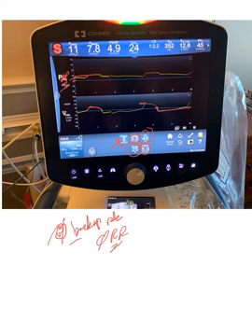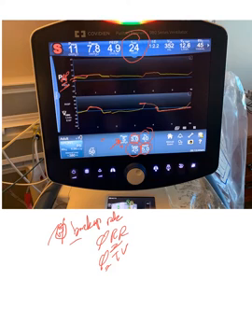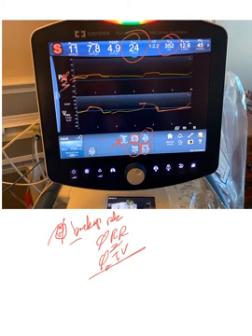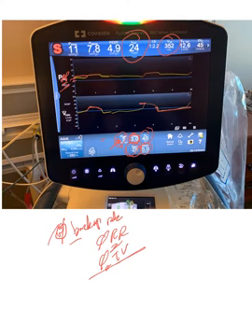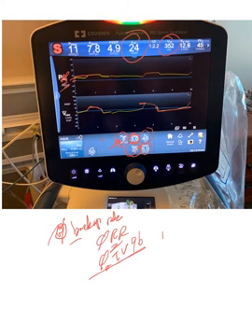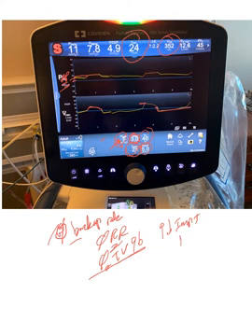There is no backup rate, no respiratory rate set — there is only the actual respiratory rate. There is no tidal volume set; it's whatever the patient can pull. We only provide the pressure support target, the trigger — whether it's a flow trigger or pressure trigger. To go up and down on tidal volume, you can adjust the inspiratory time up and down, and also the flow, because the flow rate directly affects inspiratory time.